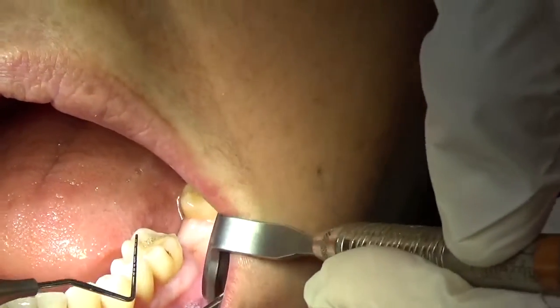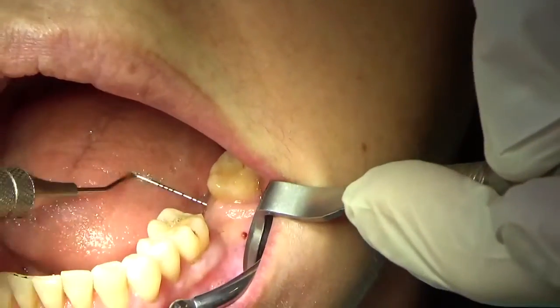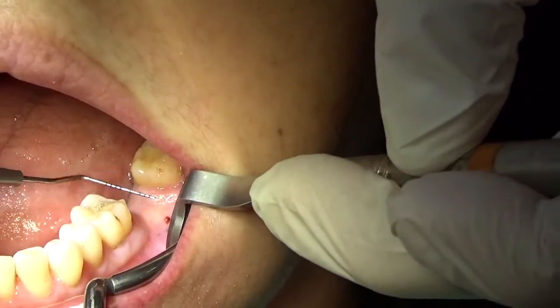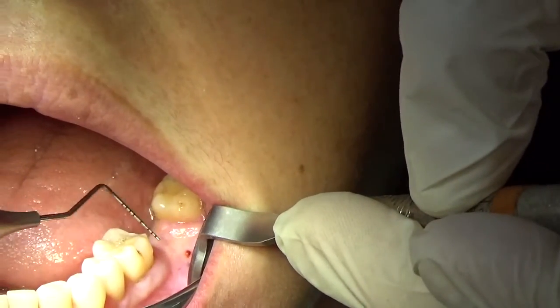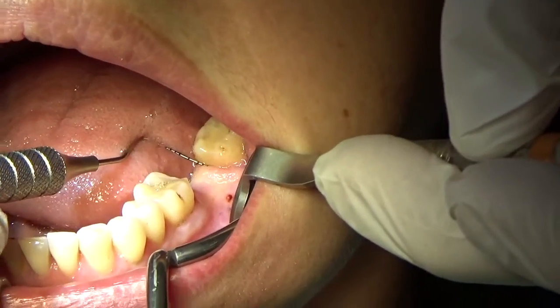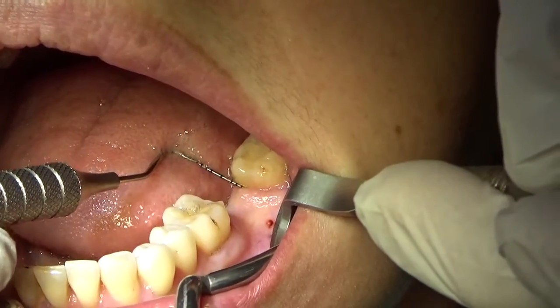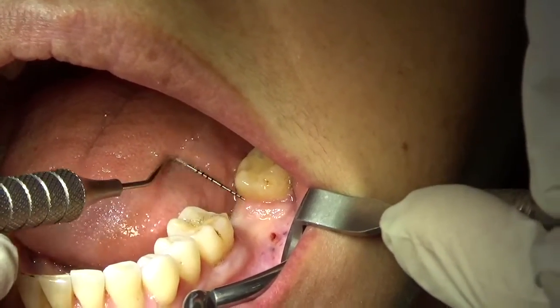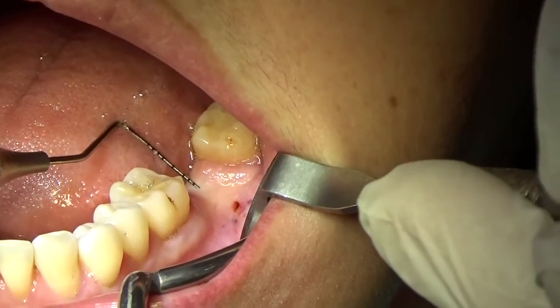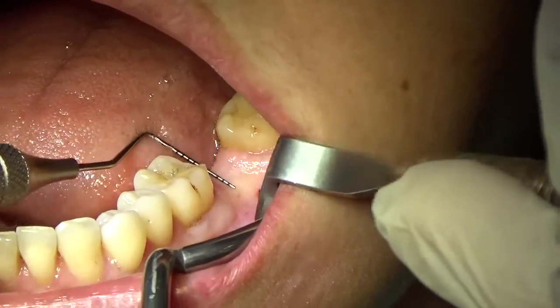So what does that tell me? It tells me we're lacking a little bit. So we're going to have to do our best to maybe not augment it, but we can find tissue from elsewhere and move it. So when it comes to my incision design, I can actually make my incision a little bit more lingual into the keratinized gingiva. If I make my incision kind of here in this area, a bit more lingual, can you all see where I'm touching? And if I make it here, I'll reflect this keratinized gingiva buccal, and I'll be able to reflect a little bit more to the lingual as well.